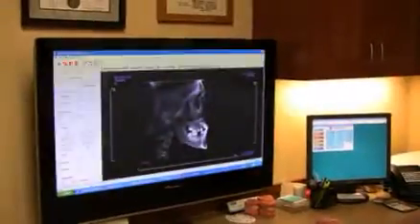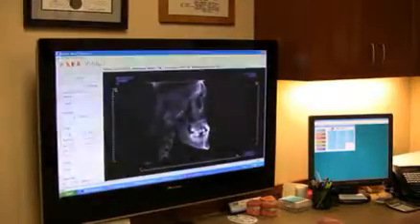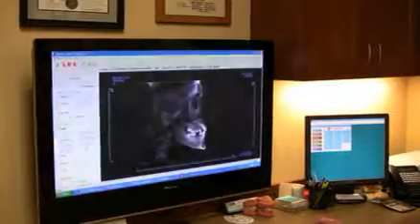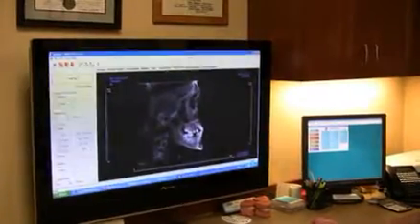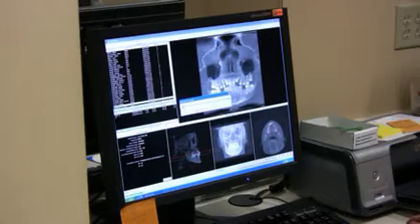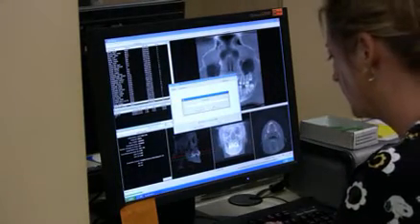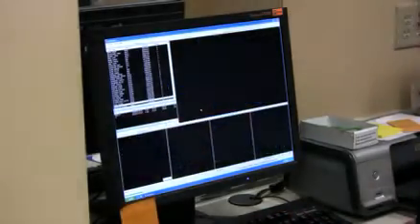And off of one film, we get all of the traditional X-rays that we need. This would be the traditional X-ray of the side of the head, and we can still take all kinds of measurements off of this. And most dentists are used to looking at the teeth in a different view, and we can still provide that view.